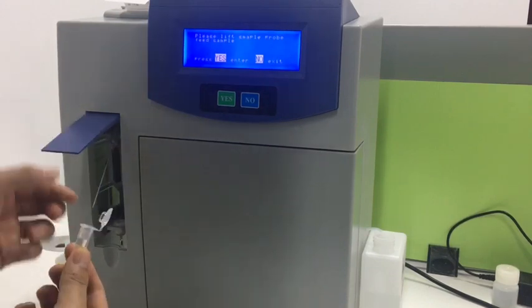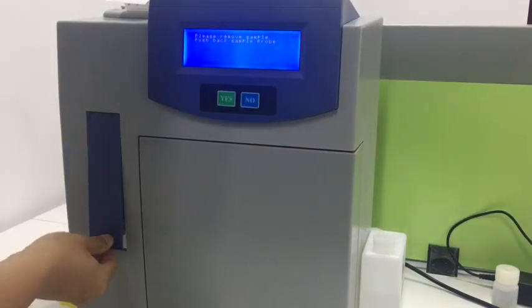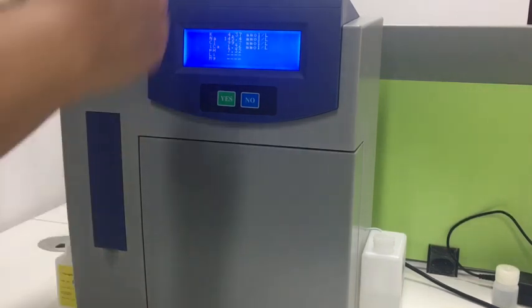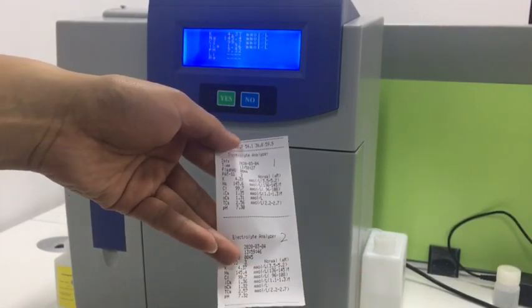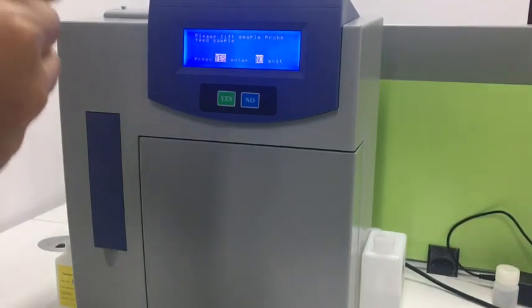Then we can do the same procedure several times to check the stability of the analyzer. This is the second result of the QC solution. We can use a pen to write down the numbers in sequence, then use a calculator to calculate the mean value, SD, and CV values to know the stability of the analyzer.